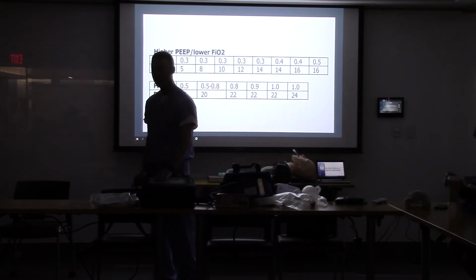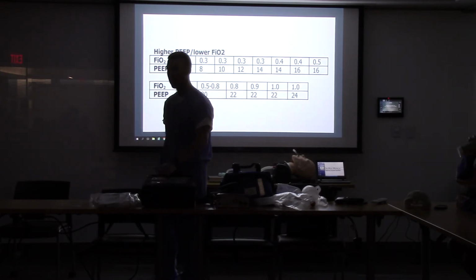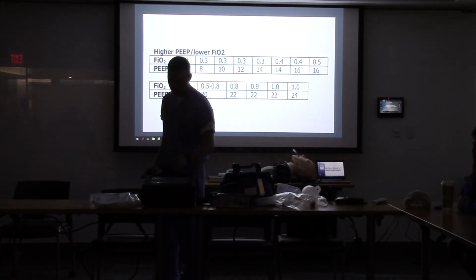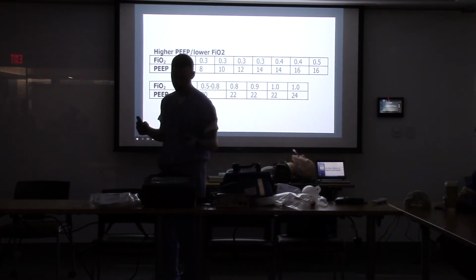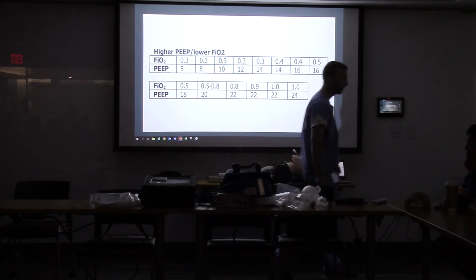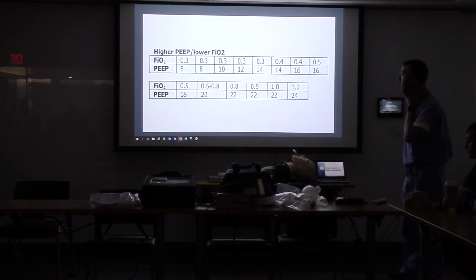It can do vent management without oxygen, just delivering at 21%, which is the equivalent of a BVM on room air. But it'll draw in and blend room air and 100% oxygen from a bottle or from the wall.